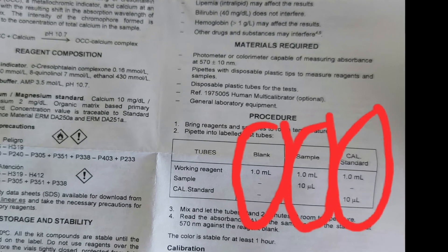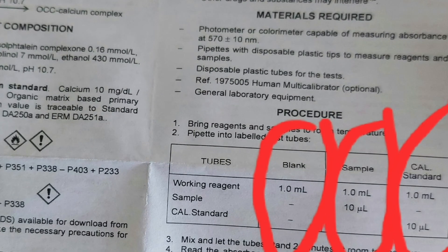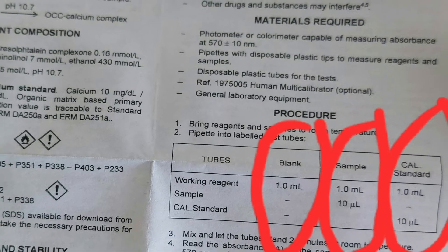This is the protocol we are going to follow. In the blank cuvette, we will take only one ml of working reagent. In the sample test tube, we're going to take one ml of working reagent with 10 microliters of sample. And in the third cuvette, we're going to take one ml of working reagent with 10 microliters of calcium standard.